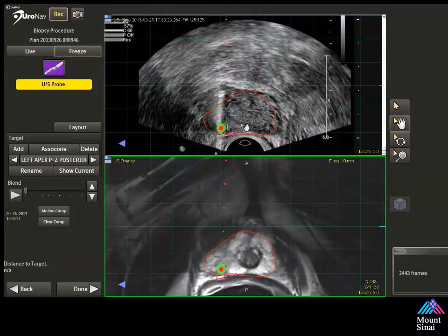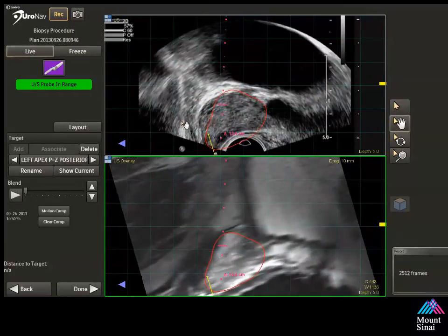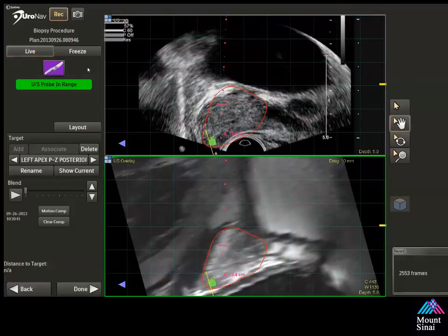See, I'm able to place the needle, fire it through the region, mark it, and record it. This allows us to compare the prior imaging with the pathology they retain. I think it's really important to have pathology review so you know if you missed a lesion or the lesion was a false positive.